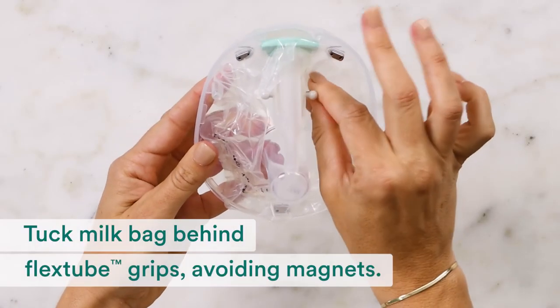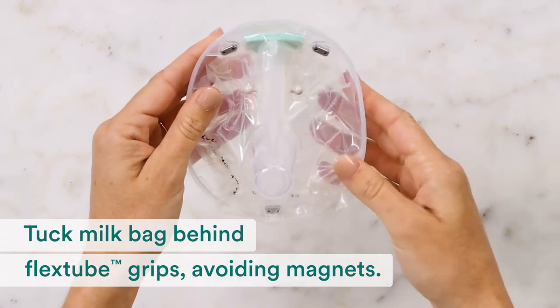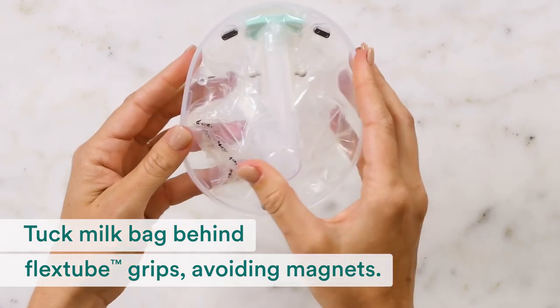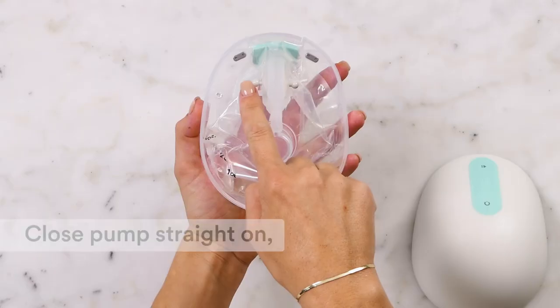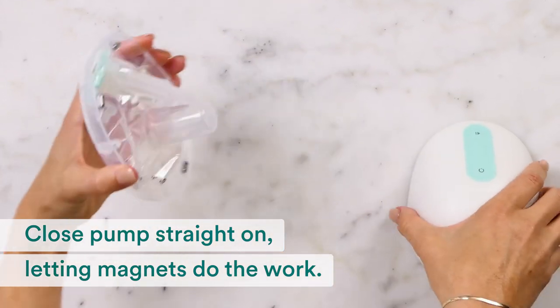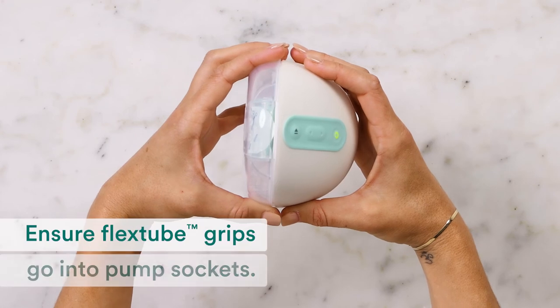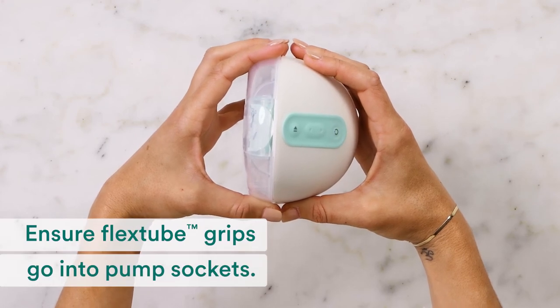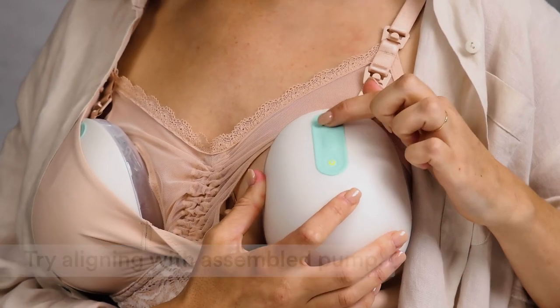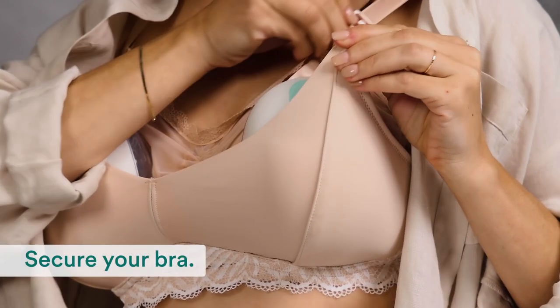Next, tuck the milk bag behind the flex tube grips. Make sure it doesn't interfere with the magnets. Let the magnets do the work as you carefully close the pump again — close it straight on, not from the bottom or the side. Make sure the flex tube grips go into the pump sockets. Try aligning again with your assembled pump. Press play and wait for your pump to begin the stimulation phase, then secure your bra.